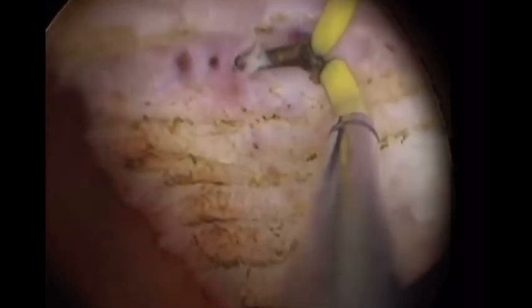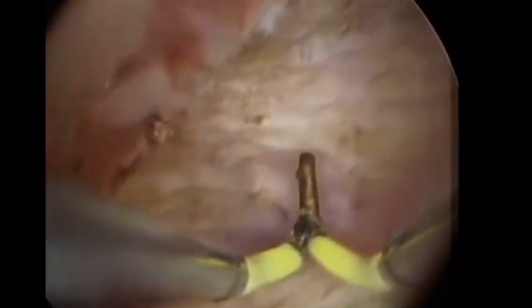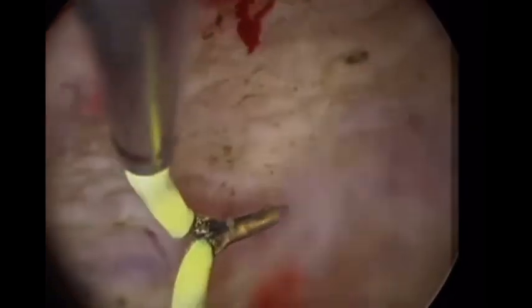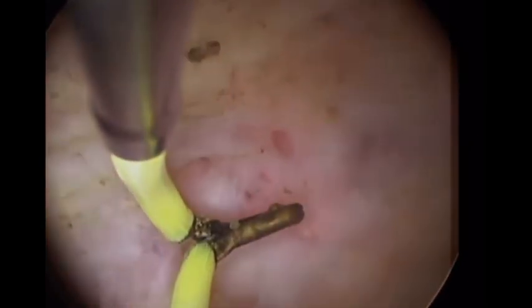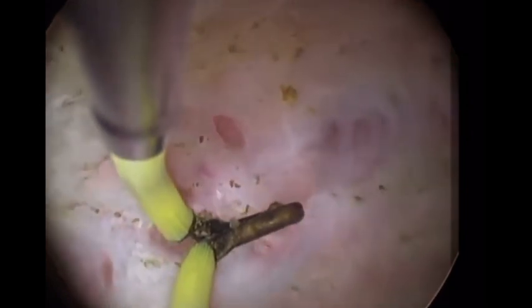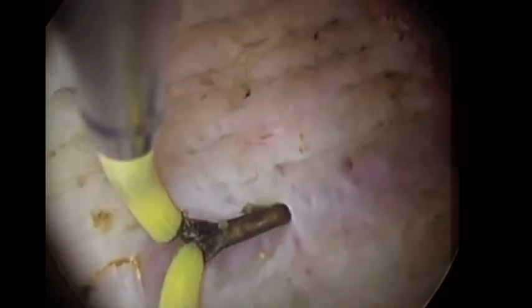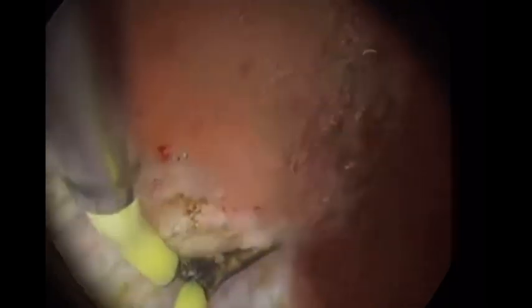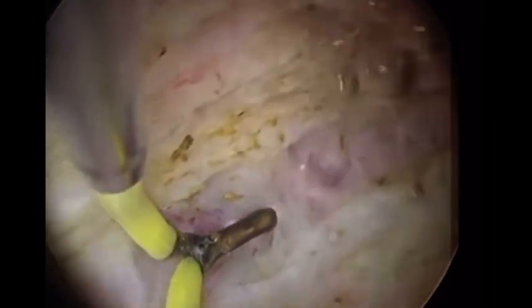Just touch and move. You will see these are muscle fibers — muscle with a little fibrous tissue. Take the tubal ostium as your GPS level. Unless you maintain a view to the tubal ostium, you might go too far up or down and then perforate. If you encounter some bleeders, don't panic — this bleeding is not serious. Move the electrode from side to side with a very steady hand, millimeter by millimeter. Sometimes move two millimeters up, two millimeters down, observing fiber retraction, then readjust your level of cut.